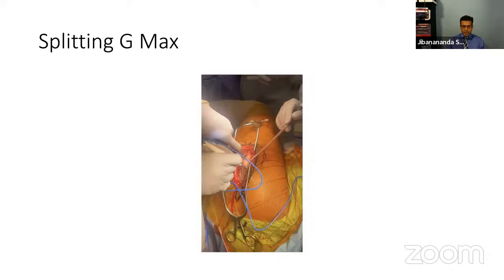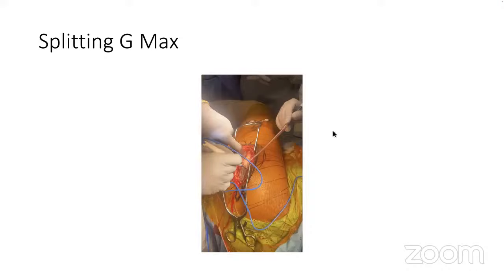The next step is your IT band. I typically start splitting it right at the top of the trochanter and below it — that's where the IT band is more aponeurotic and less muscular. Many surgeons in training try to expose the muscular layer and keep going layer by layer, which gets clumsy and takes time. It's a lot easier to open the IT band at or below the greater trochanter — it's all fascia layer. As soon as I make a rent, I put a Cobb elevator or finger underneath it, then bluntly split the muscle but cut the fascia with the bovie.